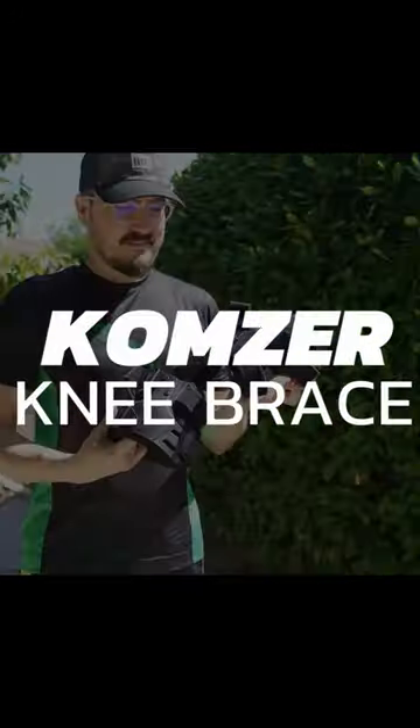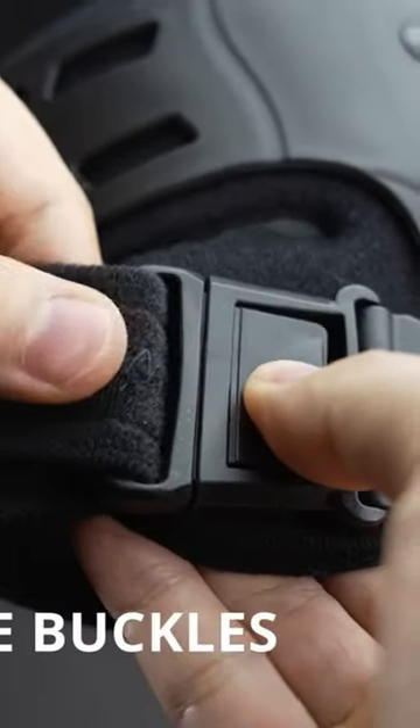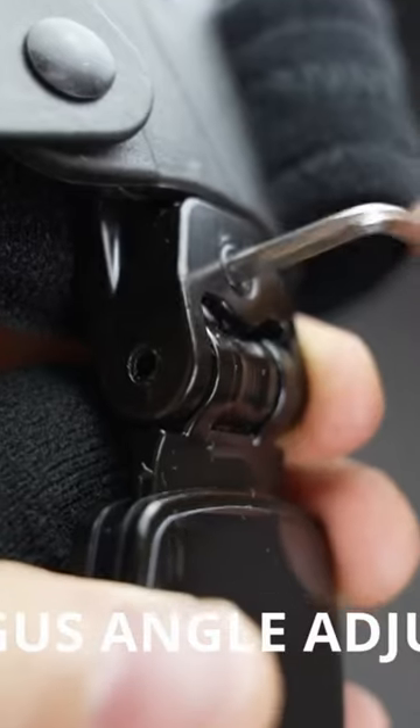Let me show you the Komzer adjustable knee brace. It has quick release buckles to make it easy to use. You can also adjust it for varus and valgus knees.